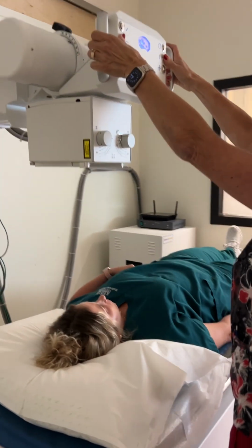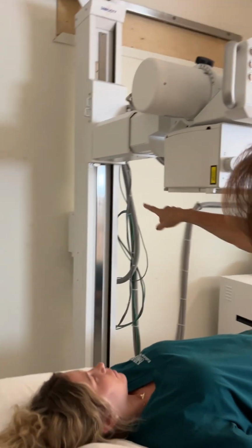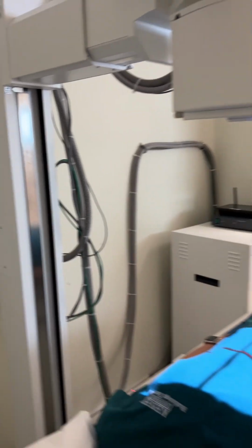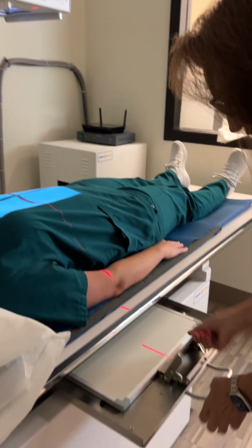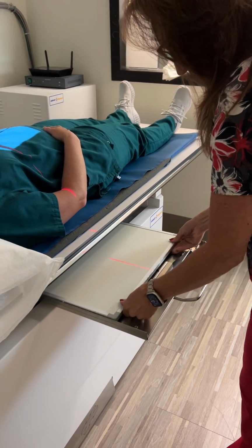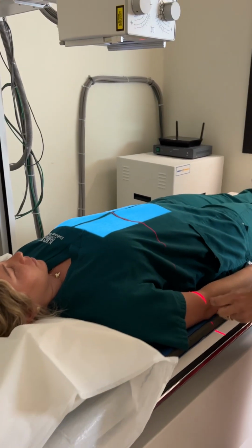So as soon as I get this positioned, so I'm at 40 inches, and you see underneath there it says to the grid. So I'm 40 inches to the grid. And this IR, I'm gonna do this first one that was left in the Bucky on accident. We're gonna go ahead and put that in lengthwise. So we're aligned there, it's in detent. We're at 40 inches.